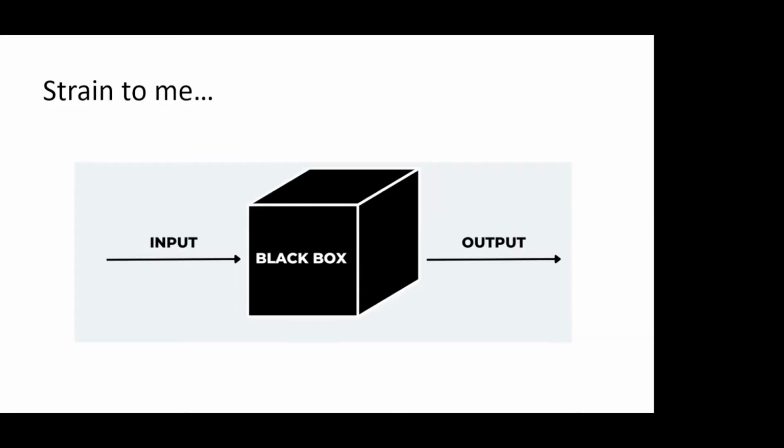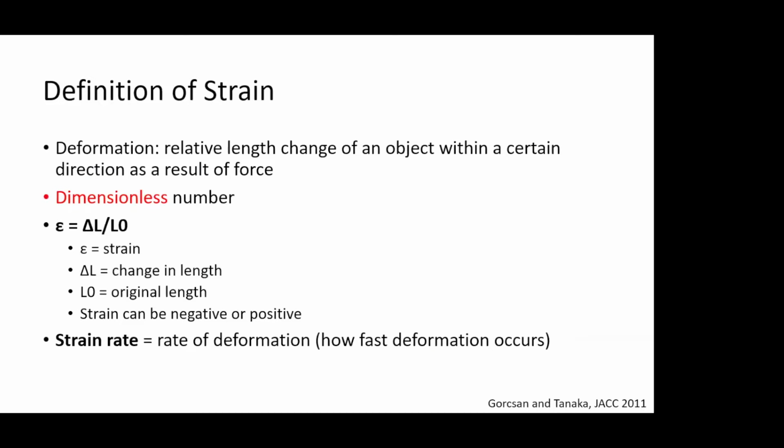So I would get an input and an output, but didn't really understand what the actual machine or the software was doing in order to calculate a number for me and what necessarily that number means. So I thought I would do a little more reading about it, and this is why I thought I would do this talk today.